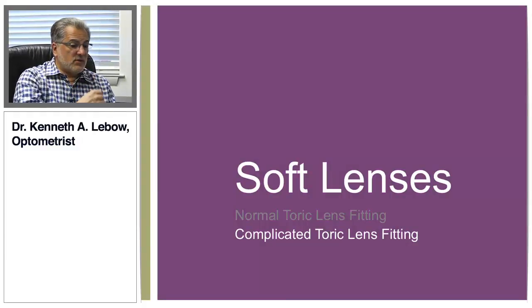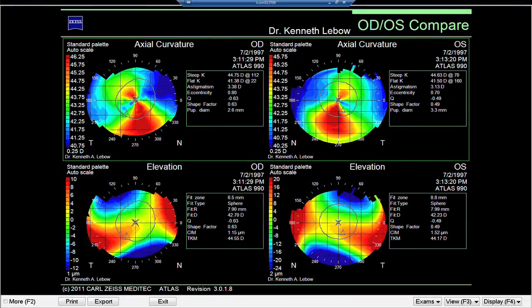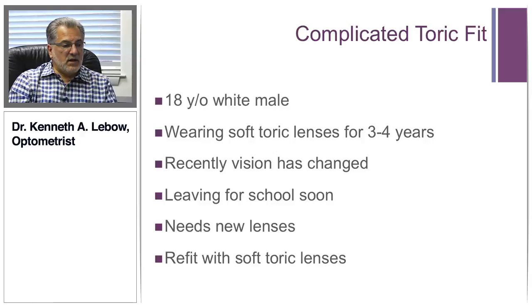Now I'd like to go into a much more complicated situation. Looking at the right-left compare, you see oblique corneal astigmatism which looks a little asymmetrical. There's a little bit more red inferiorly in both axial maps. The patient has over three diopters of corneal astigmatism in the right eye and just at or slightly over three diopters in the left eye — oblique axes at 22 degrees in the right and 160 degrees in the left.